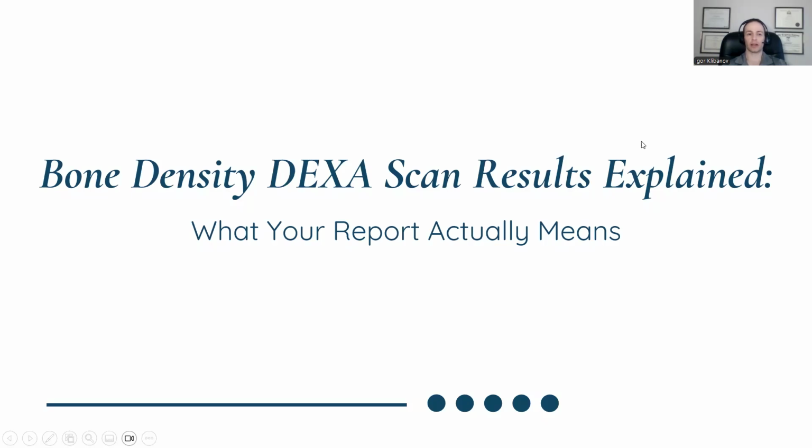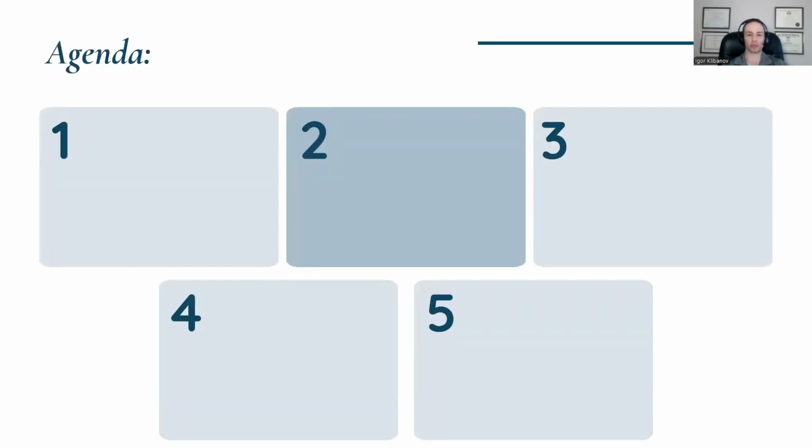If you recently got your bone density DEXA scan results and you don't know what they mean, you will at the end of this video. Here's what you can expect to learn.